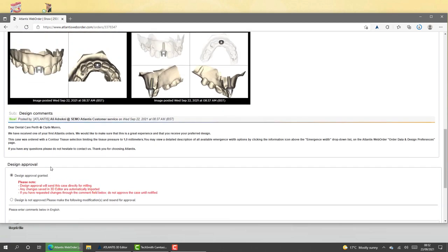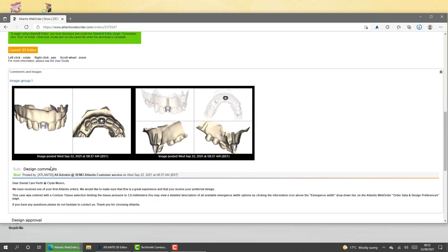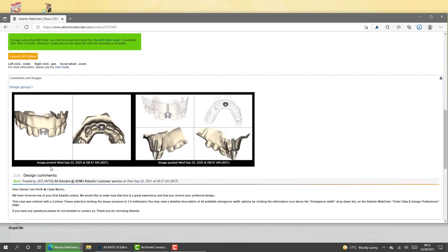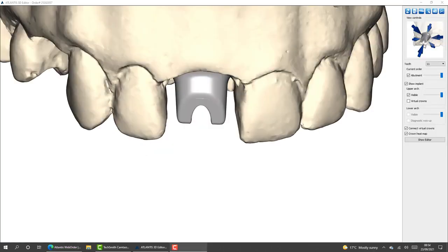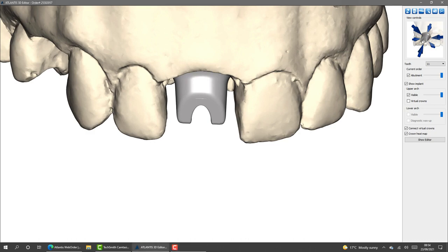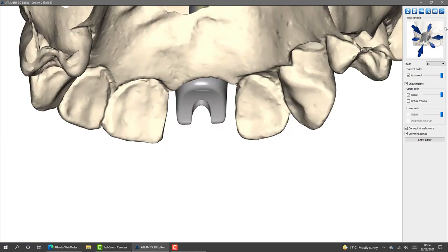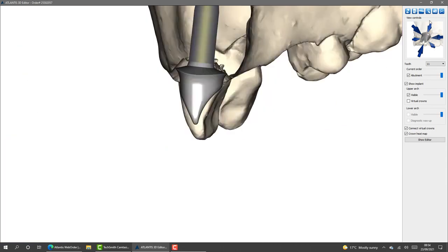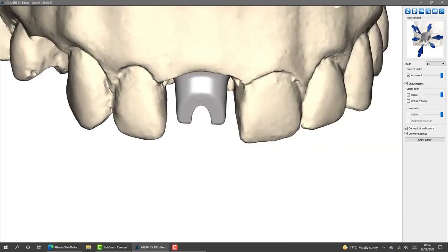And the good thing about the design here is you do have the ability to look at the design and modify and adjust it by launching the 3D editor, which opens up a separate window, and then here you have the 3D editor, which then allows you to change, modify, redesign the abutment. If you want, you can make it longer, shorter, higher, taller.